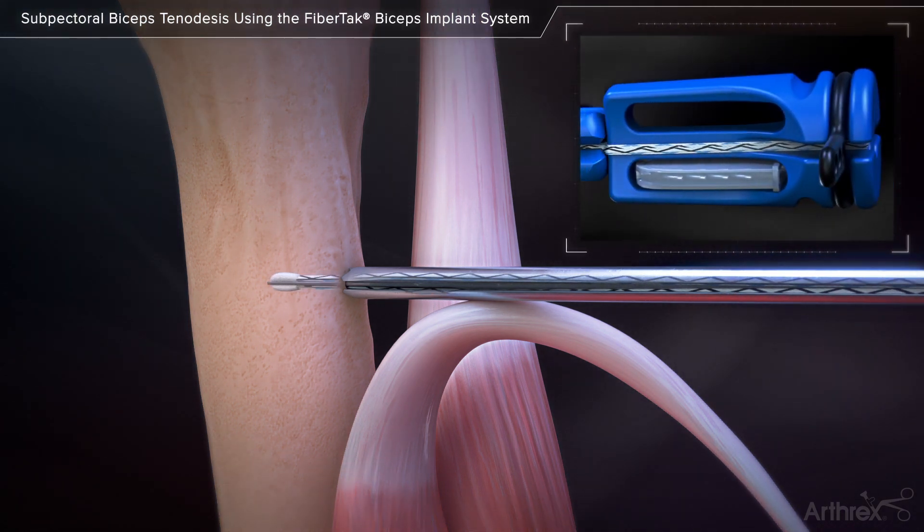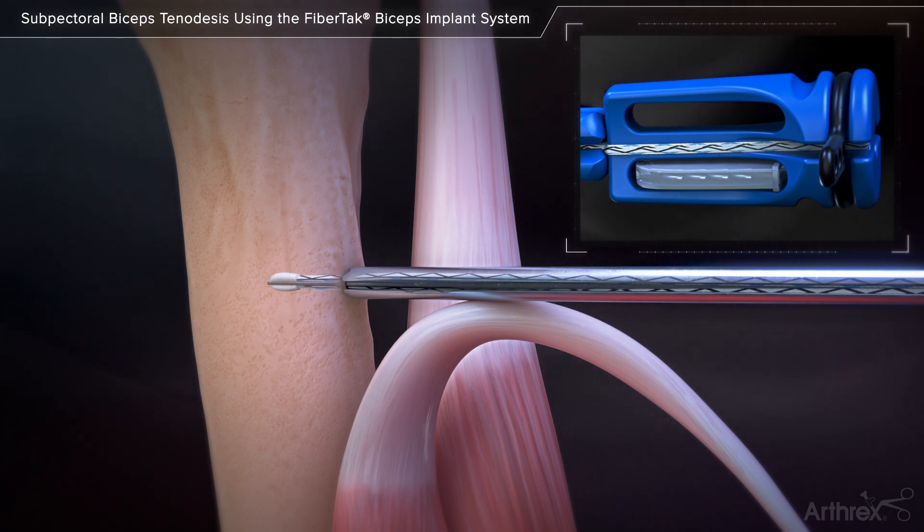Lightly tap on the inserter handle to advance the implant into bone. The implant is fully inserted once the inserter handle is flush with the drill guide.